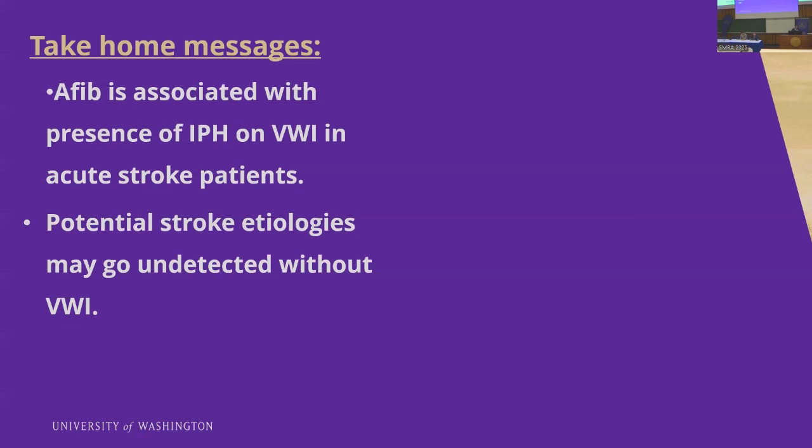Take-home messages: atrial fibrillation is associated with the presence of intraplaque hemorrhage on vessel wall imaging in acute stroke patients. Potential stroke etiologies may go undetected without performing vessel wall imaging.